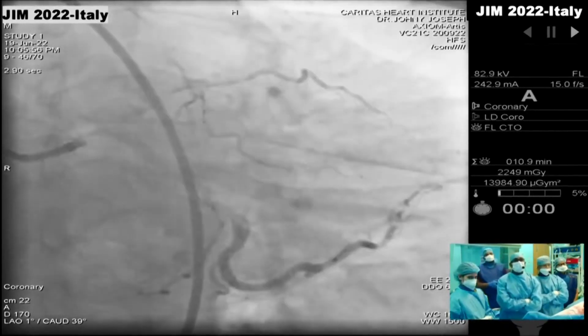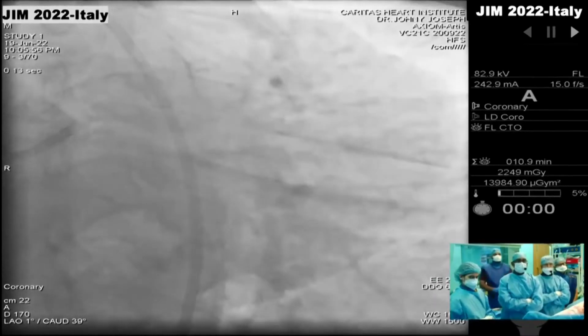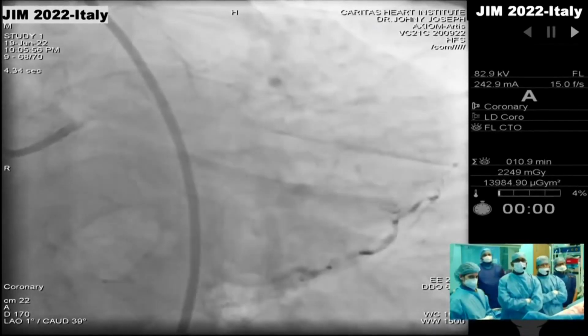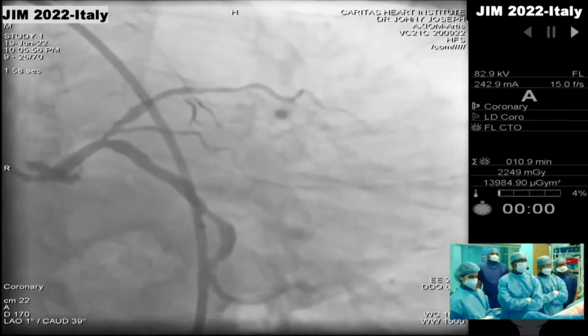Yes, certainly, Dr. Davidson, and thank you for showing these very clear images. So he's a relatively young patient, single vessel disease, excellent result, few years after a stent in the right coronary artery, but now there is disease progression and the occlusion of the mid-LAD.